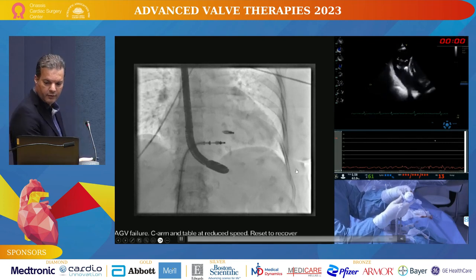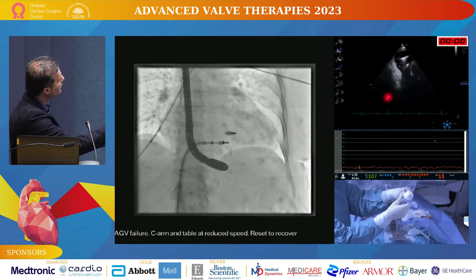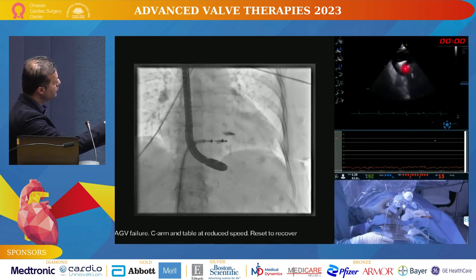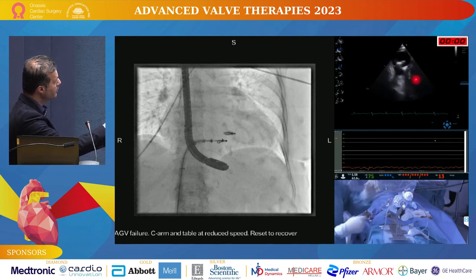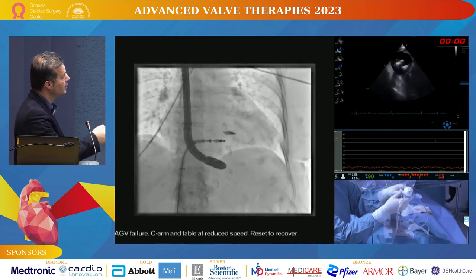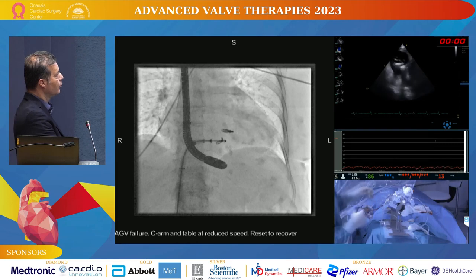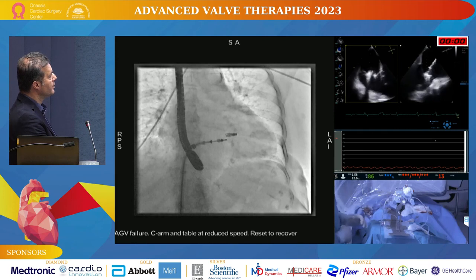Now we're going to move inside the stomach. You can see where the clip is, top right. It's a little bit more posterior than we would like. There is a big distance between the two clips, so we will move anterior, we'll push in, and then we will rotate this second clip to get a perpendicular sort of configuration. So looking at it, it has to go a little bit counterclockwise, which we will do in a minute, but we just take care not to impinge on the leaflets, not to move too anterior or too posterior.